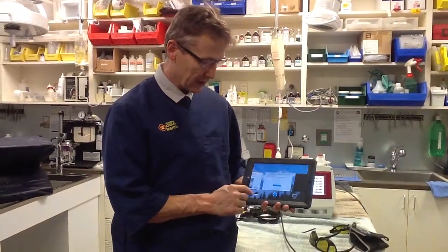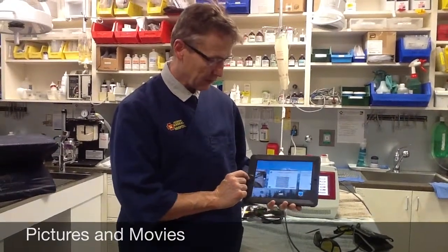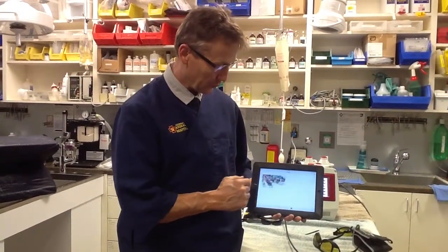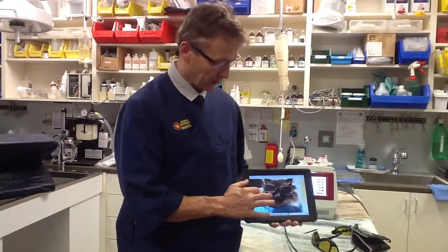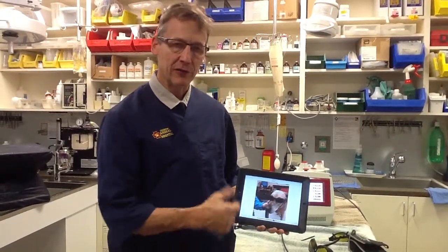Don't forget the use of the iPad as a camera. You can take still photographs and movies of all your patients, record those, and email them to clients. Here's our kitty cat with her doggles on — clients really like this aspect of recording treatment before and after. You can do wound before-and-afters, and you can use this in other parts of your practice for dentistry and suturing, and so on. Take advantage of the laser liaison continued training, the clinician's corner, the AMLA training, and also your local representative.